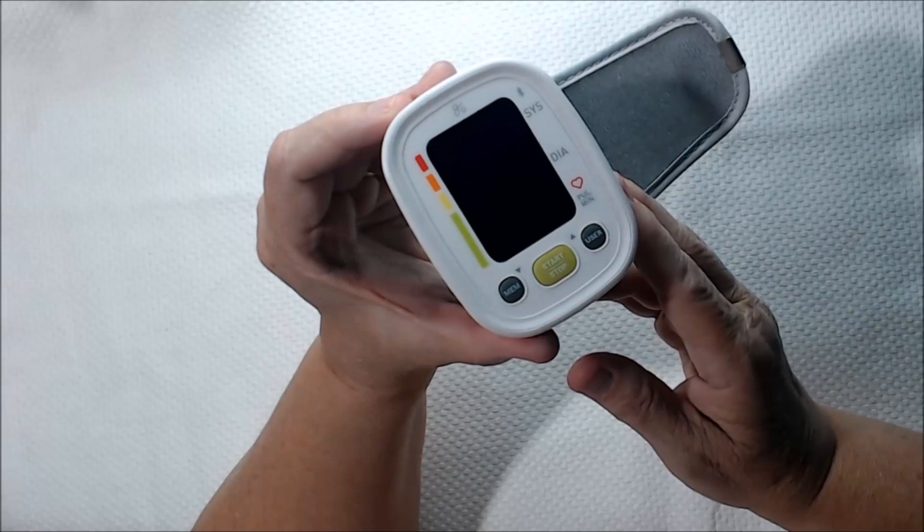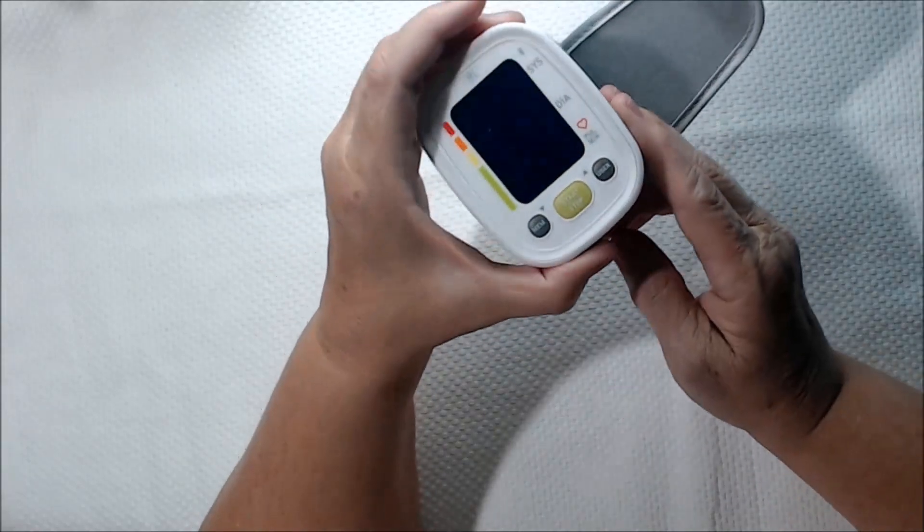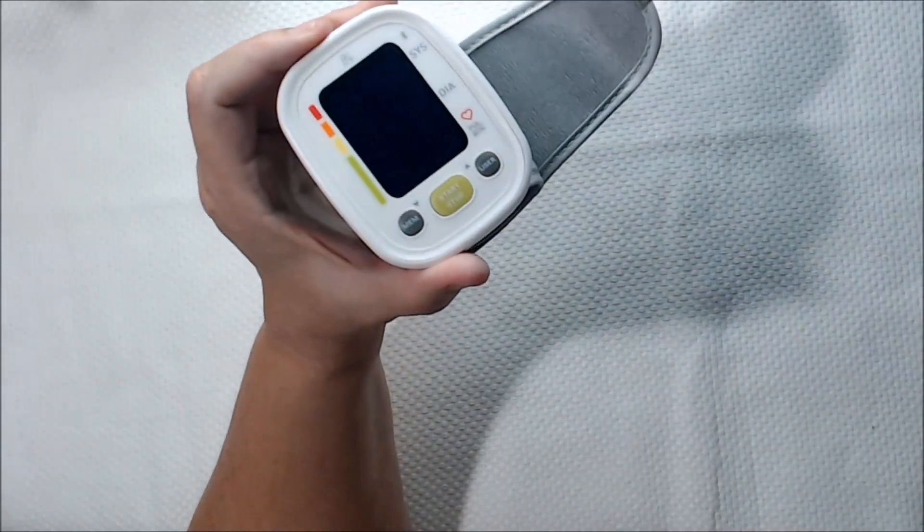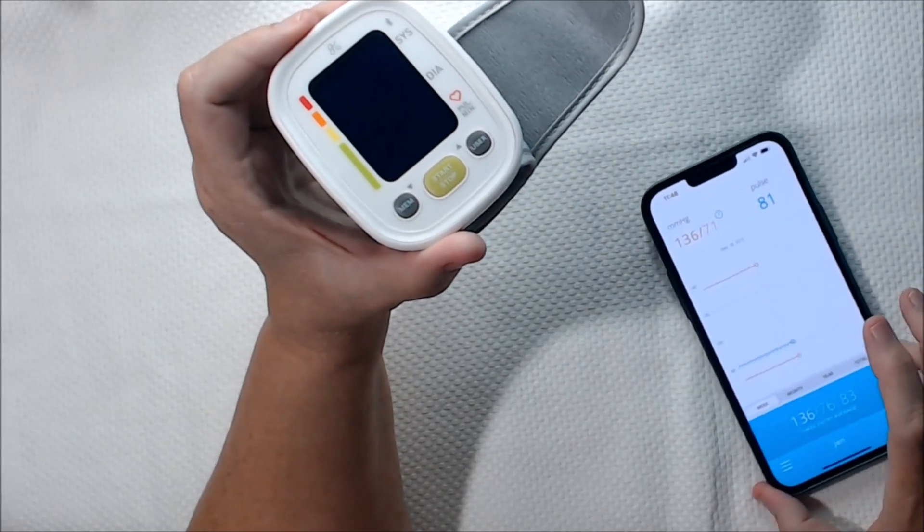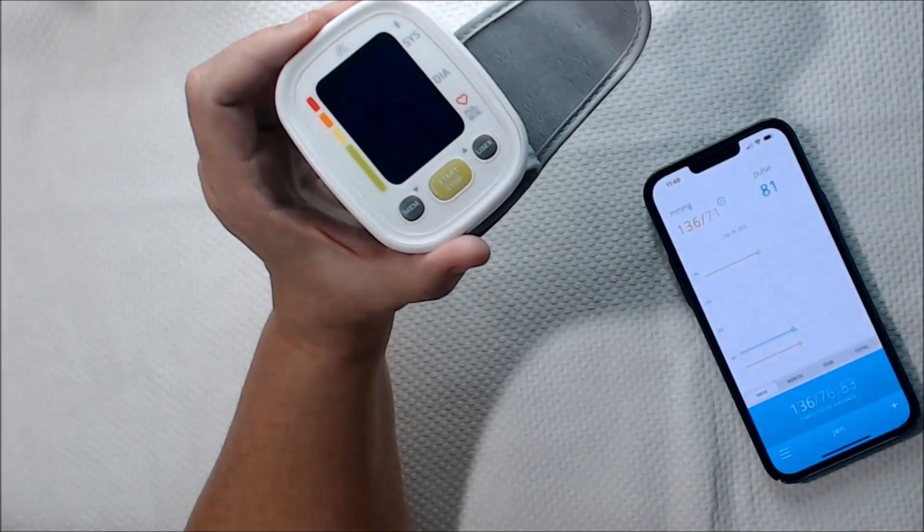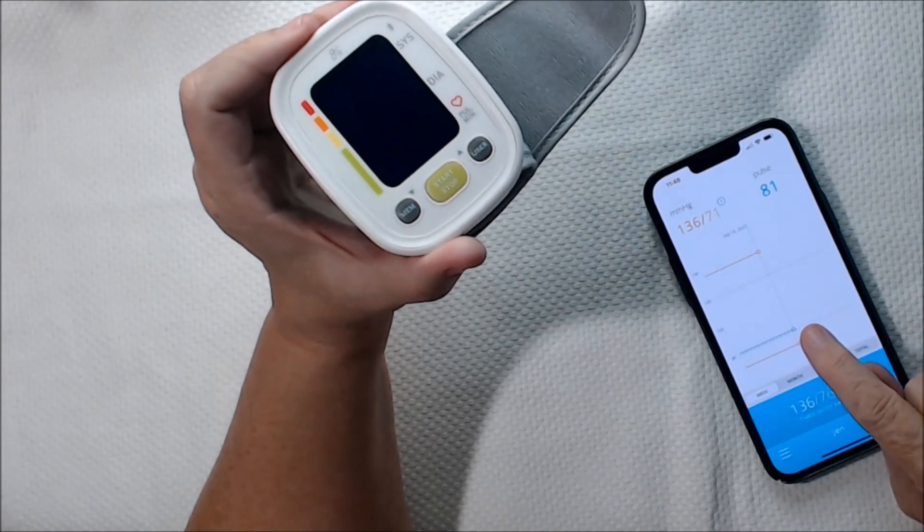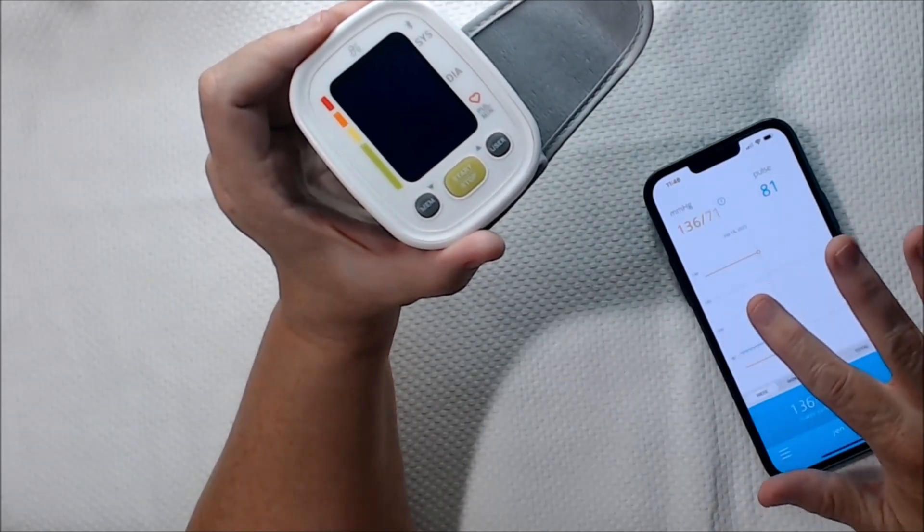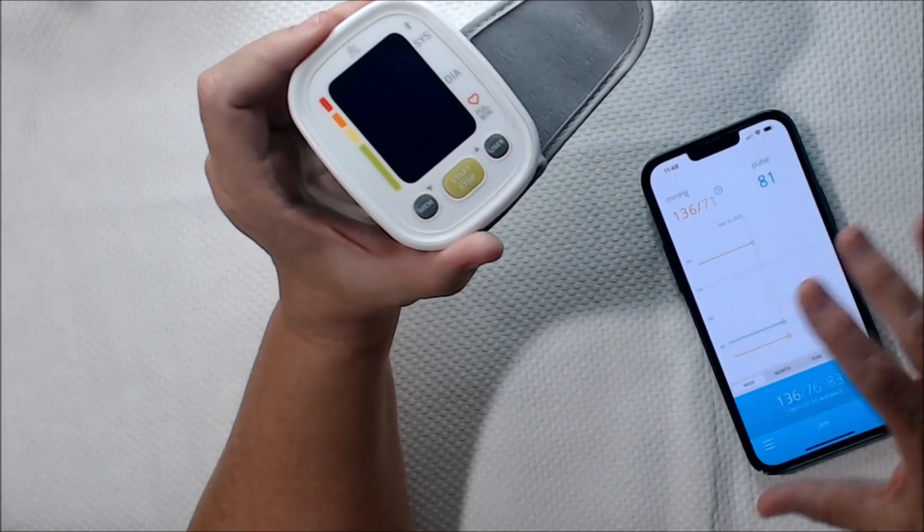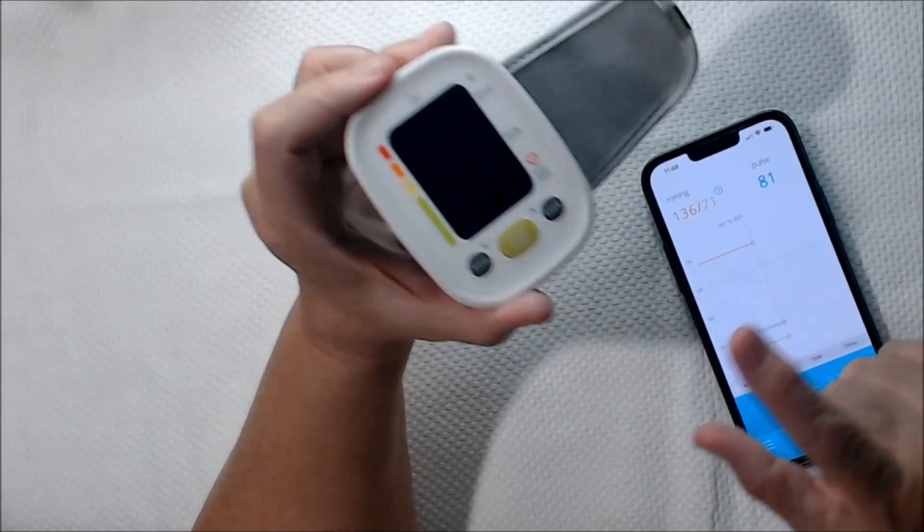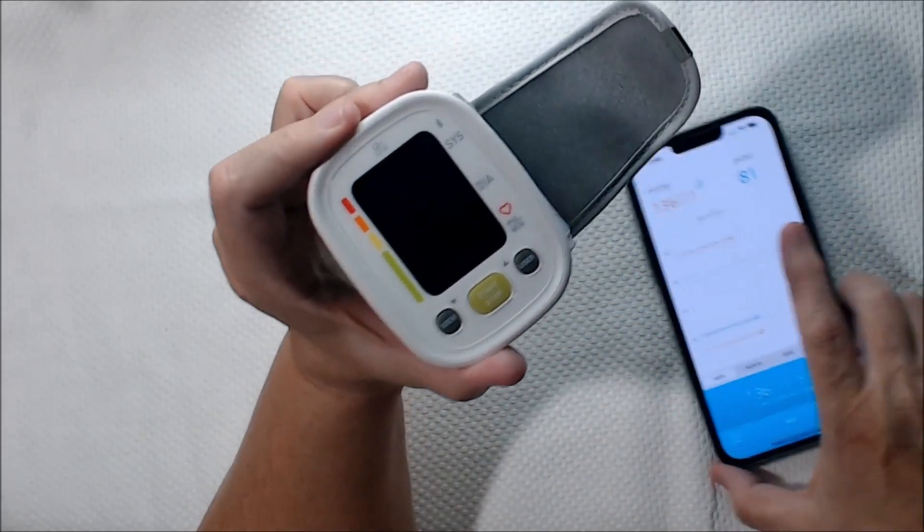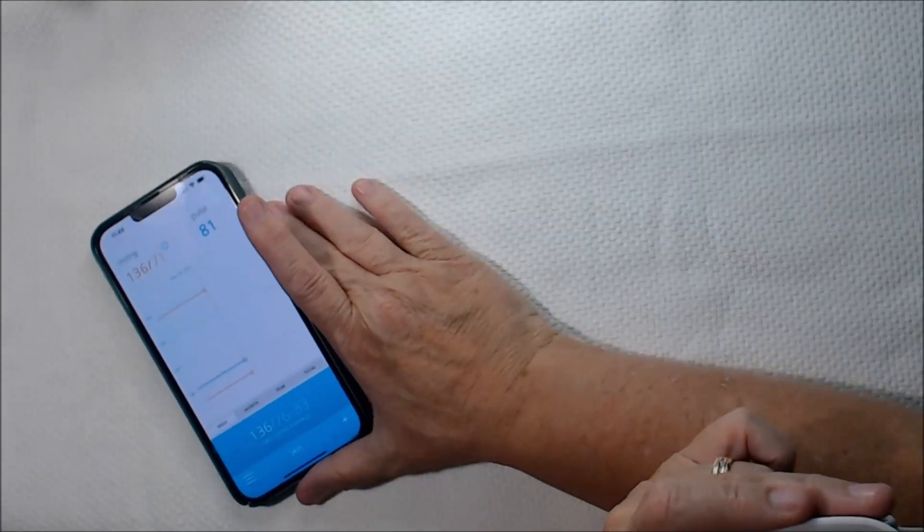Let's go ahead and take a blood pressure, see how it works. It does come with an app that you can join and set up your profile, and it'll keep track automatically of which user is taking their blood pressure. So let's take my blood pressure and see if the app will update.